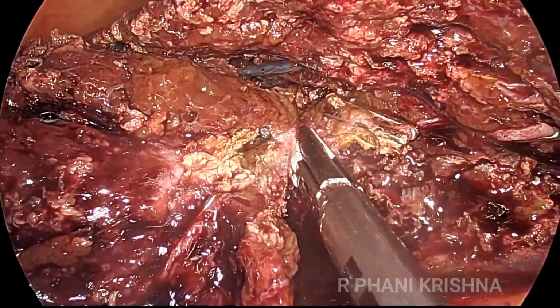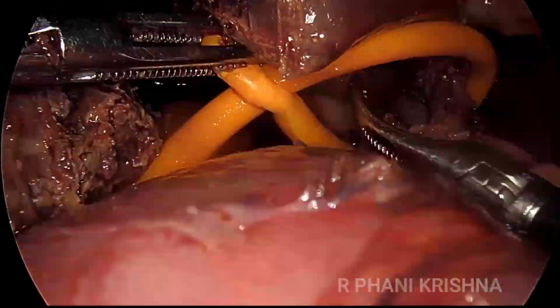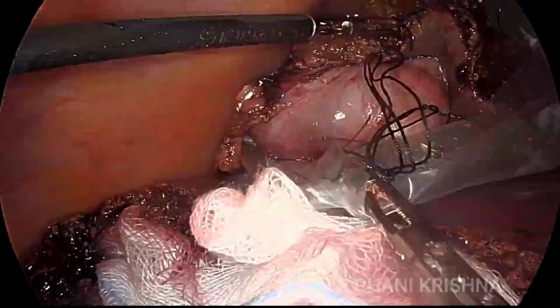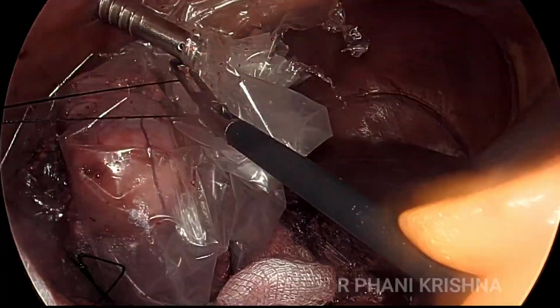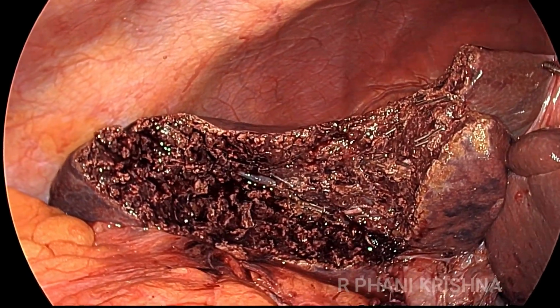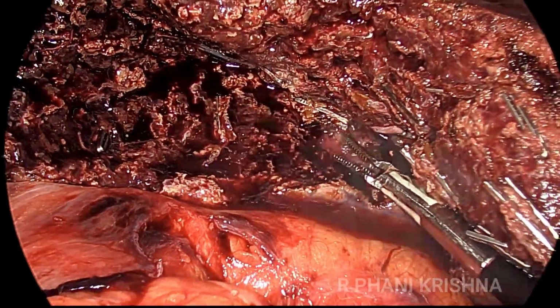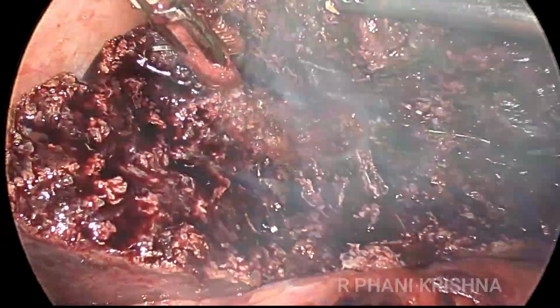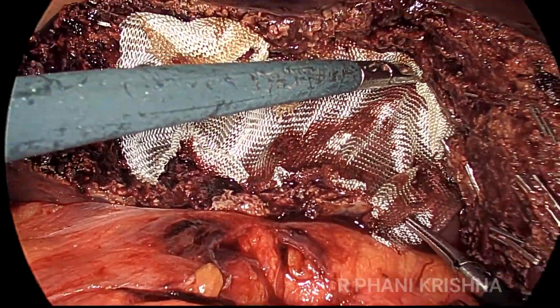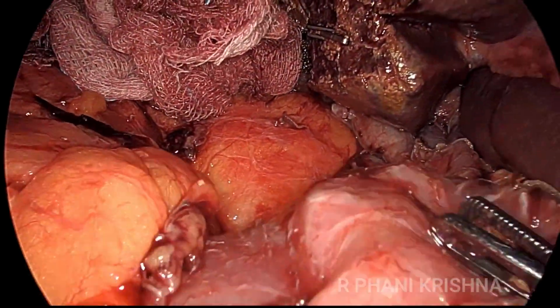That's one last Glissonian pedicle that's being divided to extract the specimen. The inflow occlusion tube is being removed. The specimen is put in a bag. The bed is being inspected for any bile leaks or bleeding. We ask the anesthetist to fill up the patient. The bipolar is a very useful tool to do hemostasis of the liver bed. A Surgicel is placed on the liver bed, and a drain is also placed in the right upper quadrant.